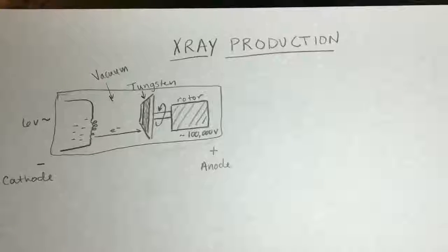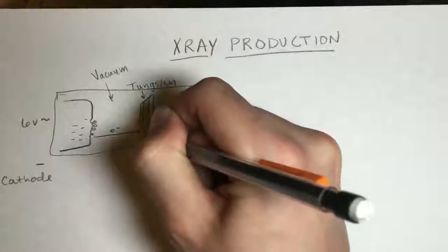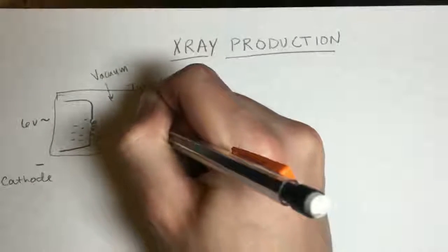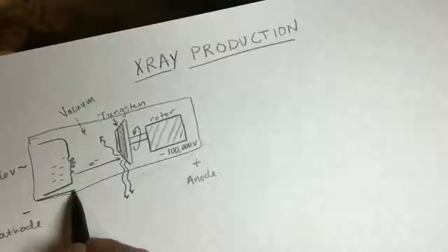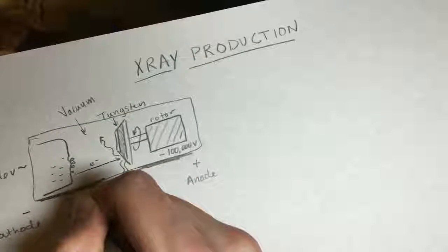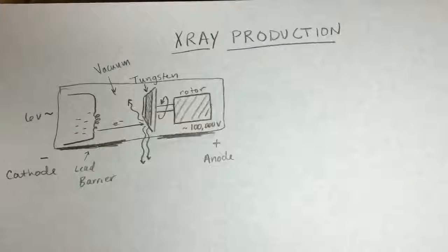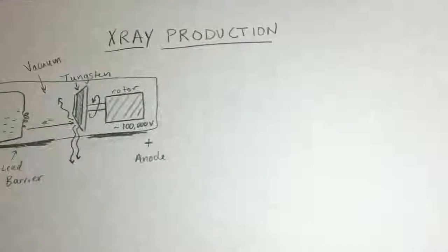So you can see that the tungsten is angled to try to deflect the X-rays downward in that direction, and they'll go all over the place, but if we can angle them down, that's what we're really going for. And when they do go all over the place, there's typically lead shielding around the apparatus to prevent those X-rays from encountering another person that it's not intended to, or go to another area that it's not intended to. So because it heats up so much, there's a rotor connected to the back of that tungsten anode that is really rapidly rotating it to help dissipate that heat.